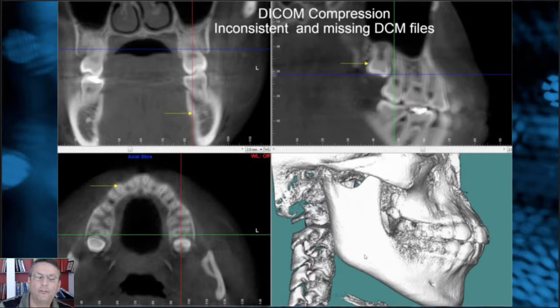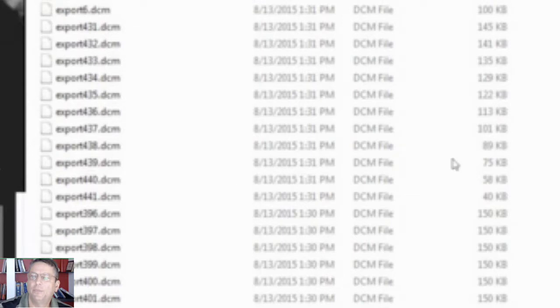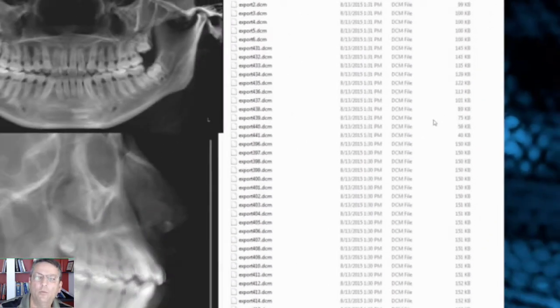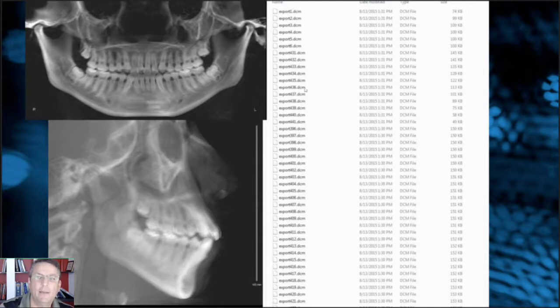All DICOM files are supposed to be the same size. This particular scan, when it became corrupted, had files of different sizes. You can see that these file sizes are all different, and each one represents one slice. So you might take the scan and when you export the data, it can be corrupt. If you get a message from your customers saying they can't utilize the scan data, check to make sure the files were exported correctly. This can produce double images because the files are not set up correctly.